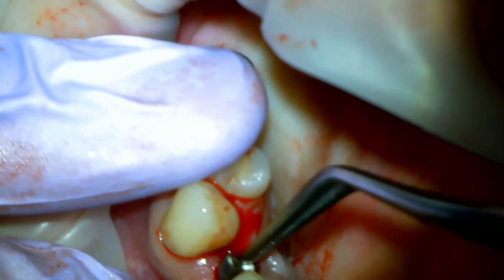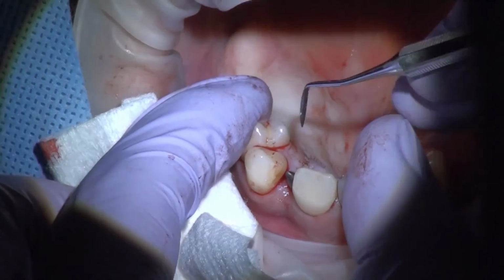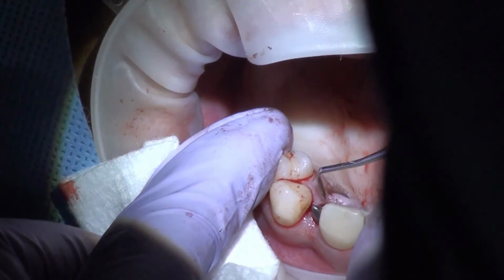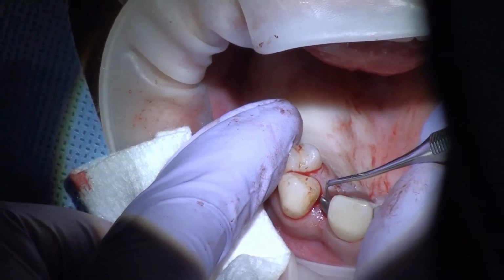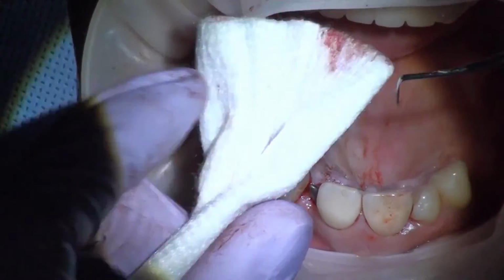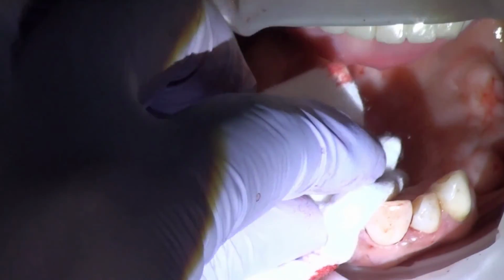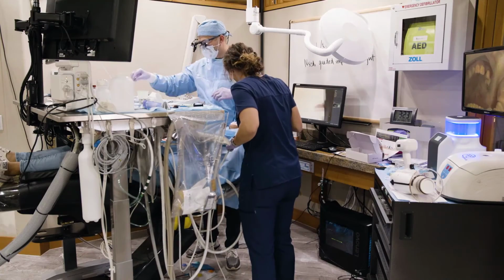Here's a little Teflon. Chin up real high. Go ahead and water that, clear that up real good.